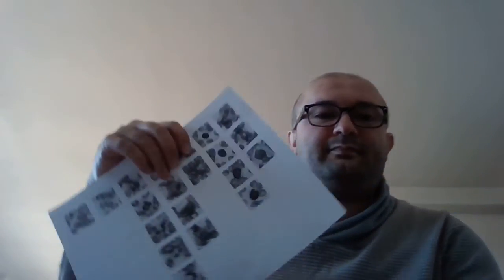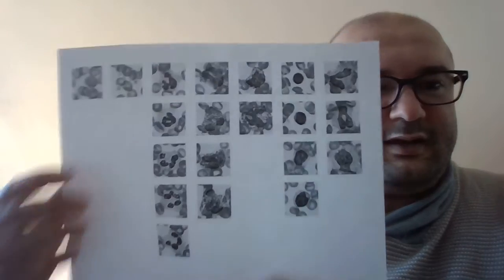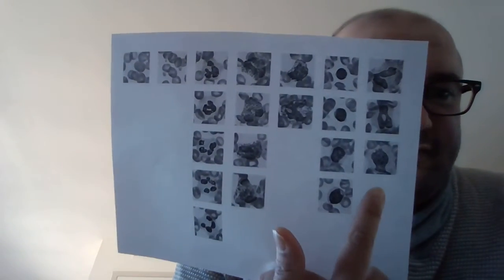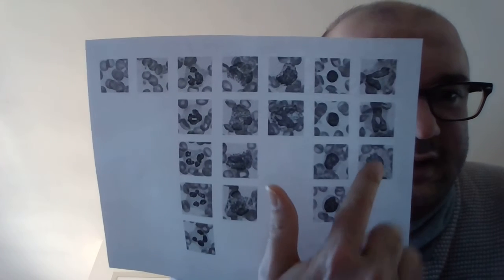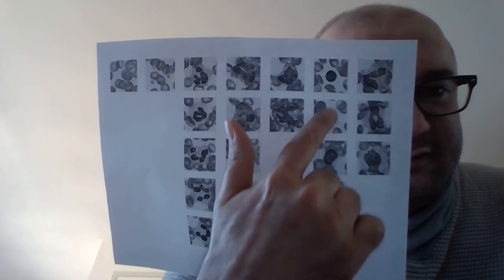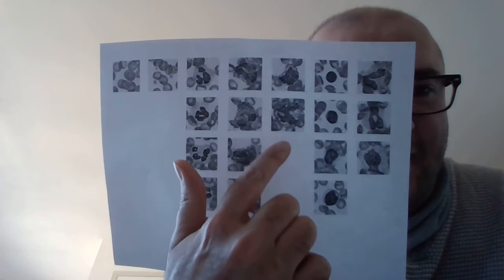And also we can sort our visualization into different categories, to see how white blood cells show in different ways. Here is a good thing that we can have. Here is the first one. This is a monocyte. You can see it like this. And the lymphocytes, you can see like this.